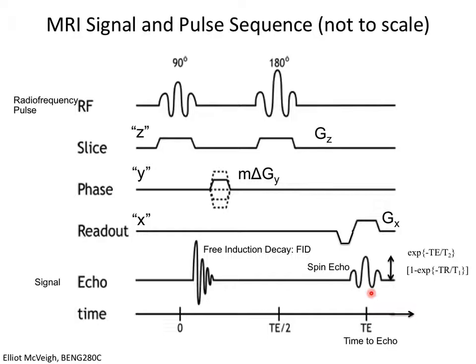The position of magnetization vectors in the volume are encoded by the application of magnetic field gradients, which changes the phase of the magnetization vector in the transverse plane. And that phase is changed because the frequency at which it's precessing changes depending on the magnetic field. And so if I apply a gradient in Y, for instance, magnetization vectors higher up in Y will precess faster than those below. And then after this pulse is finished, it will leave a residual phase shift that's proportional to the position of the magnetization vectors.